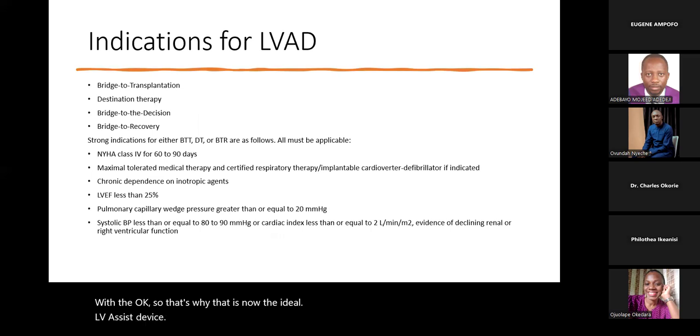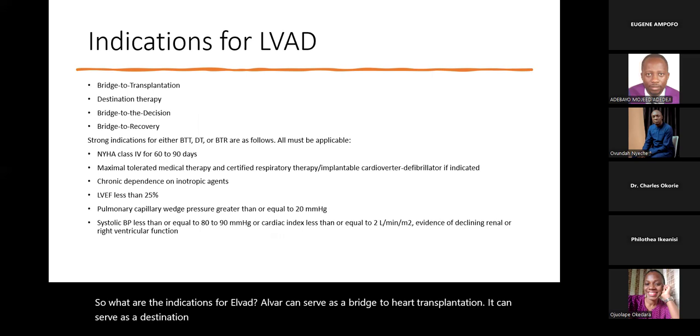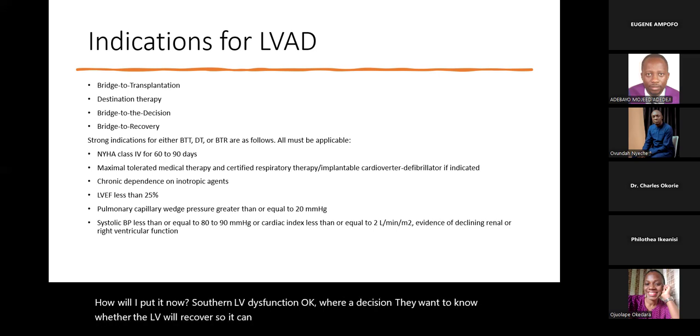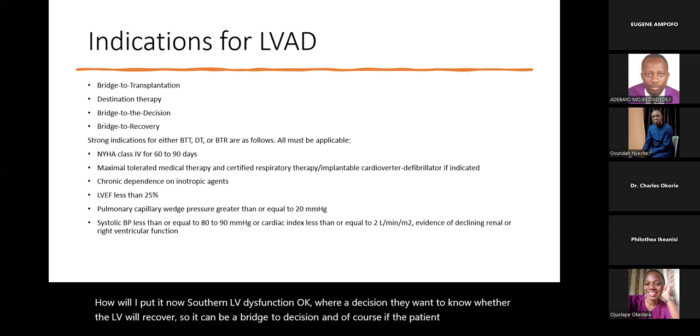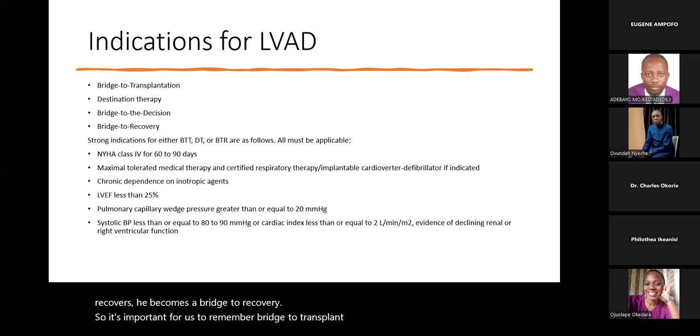So what are the indications for LVAD? LVAD can serve as a bridge to heart transplantation. It can serve as a destination therapy too, in people in whom transplant is contraindicated. It can serve as a bridge to decision in people with sudden LV dysfunction, where they want to know whether the LV will recover. And of course, if the patient recovers, it becomes a bridge to recovery. So it's important for us to remember bridge to transplant, destination, bridge to decision, and bridge to recovery.